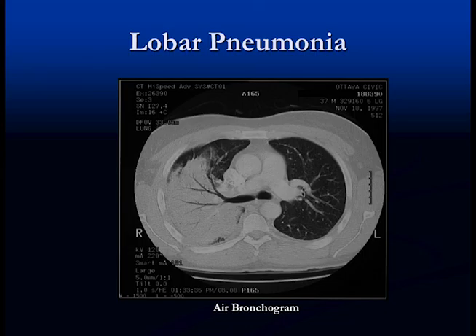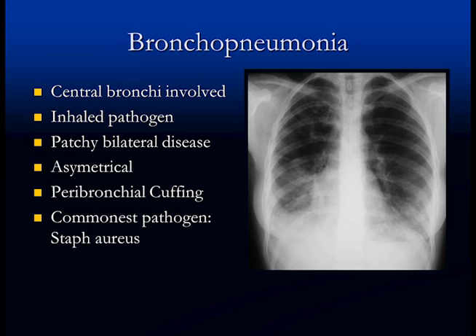When lobar pneumonias resolve, they clear completely because most of the reaction is fluid in the air spaces. Here's another example — consolidation in the left lower lobe. On the lateral view going down, it gets white at the bottom and we've lost the left hemidiaphragm centrally — this is a left lower lobe pneumonia. Another characteristic of lobar pneumonia is the air bronchogram. On CT scan we can see a large predominantly unilateral area of consolidation, solid lung, no volume loss, and an air bronchogram. This is a lobar pneumonia.